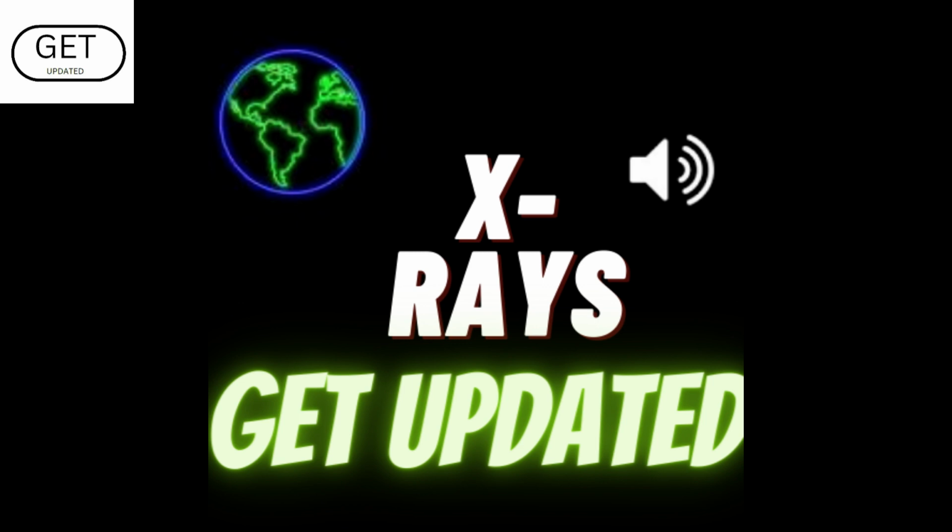Fluoroscopy. This technique uses X-rays to visualize real-time images of the body as it is in motion, such as the movement of the digestive tract or blood flow through the heart. Fluoroscopy is often used in surgical procedures and to guide the placement of medical devices.